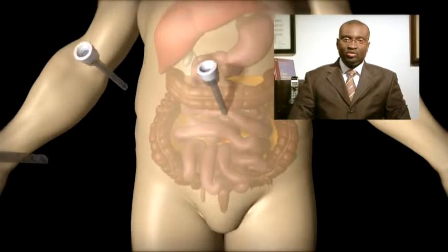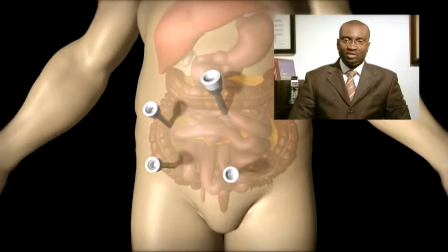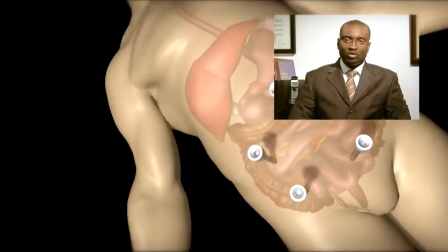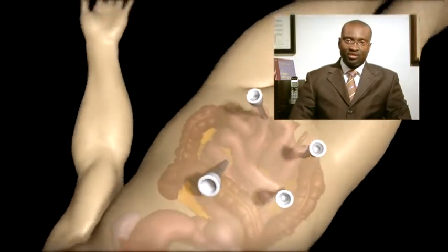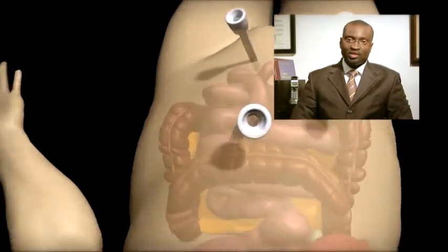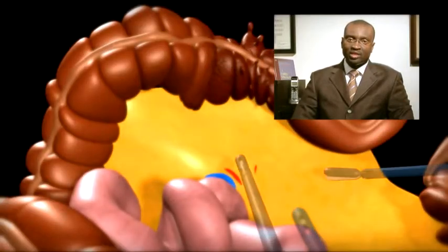Laparoscopically, using only a few small incisions, this portion of the colon can be removed safely, accomplishing this major surgery with only a two-night hospital stay.